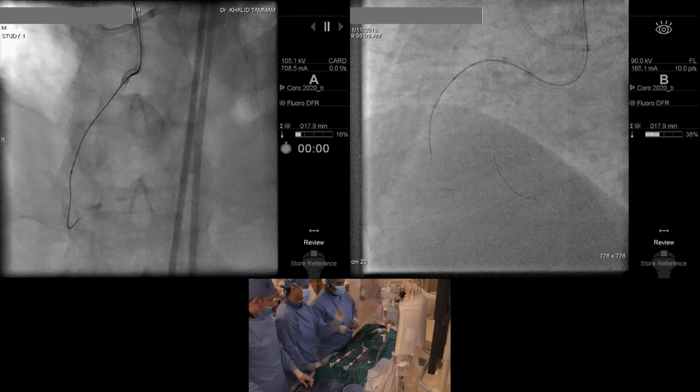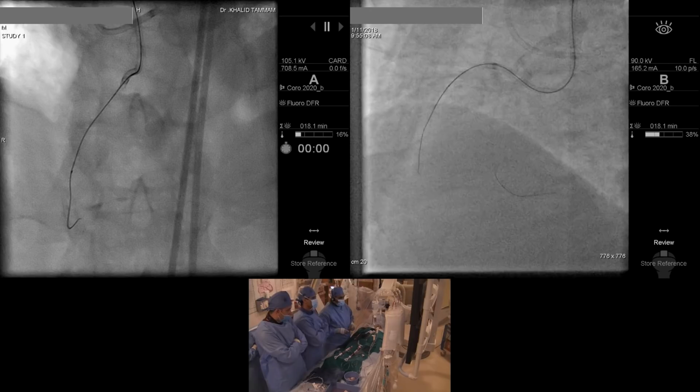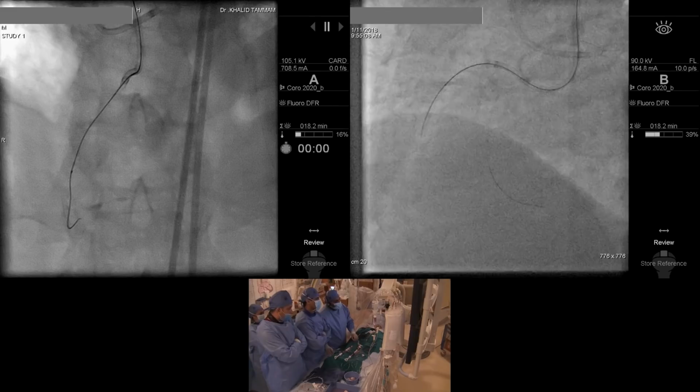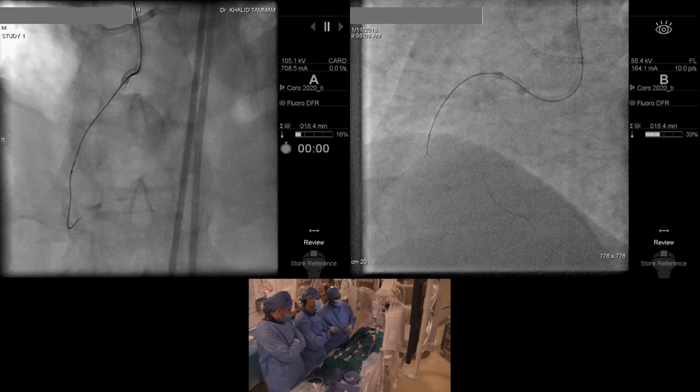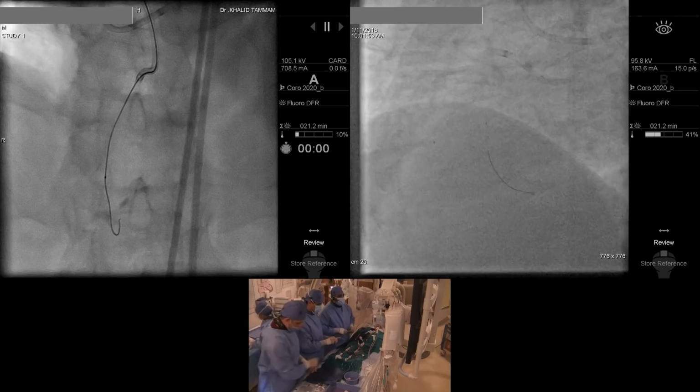I think there is a peak angle at the distal part of the RCA and the axis angle here, the right ventricular branch. So you need a wire that can take this curve and shape with this angle. Yeah, I think you are correct, Dr. Khaled. Then I need a second curve to go here because we can see calcium, but as you see here, the Gaia is already broken. Okay, so we are still with the Gaia 2, but Gaia 2 is broken. Yes, I change now to Gaia 3.